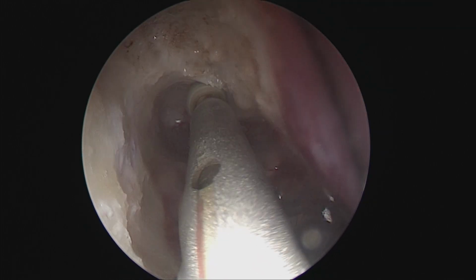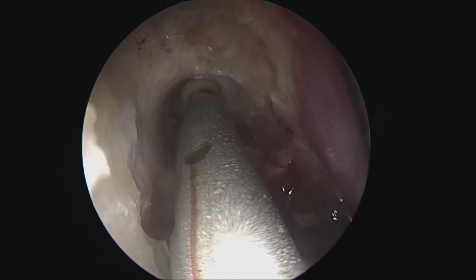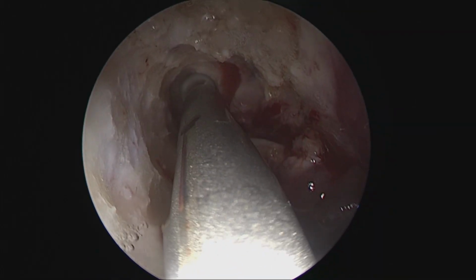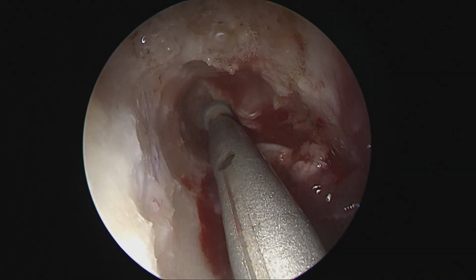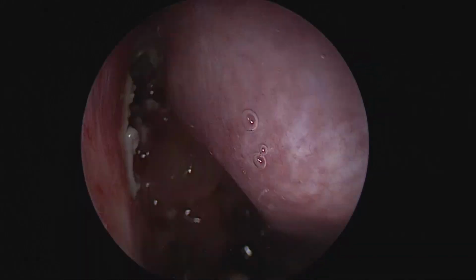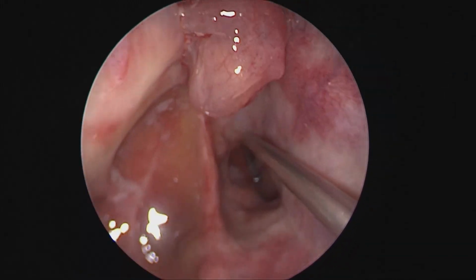And apart from the anterior boundary of resection, it is also imperative that whatever the frontal sinus is, it must be clearly opened for any irrigation and for remucosalization of this region, because if one does not open this region adequately and even removes tumor, this could lead to a very refractory and bad kind of frontal sinusitis or mucocele formation, which would create a new set of complications and problems.